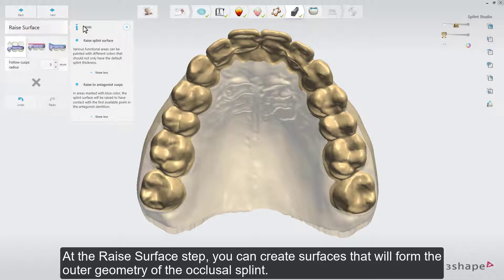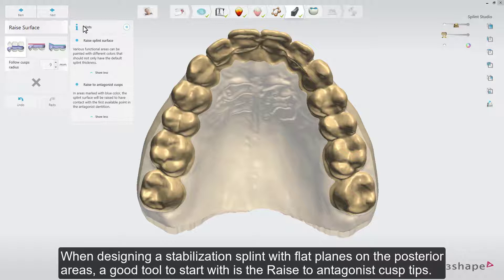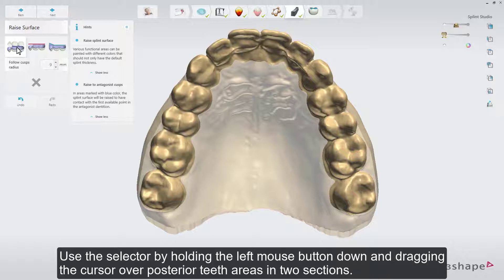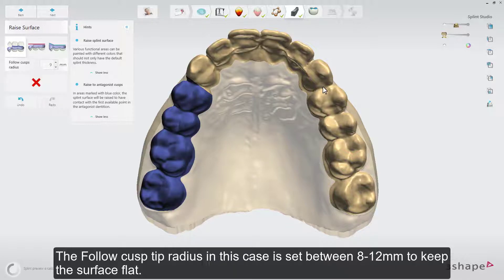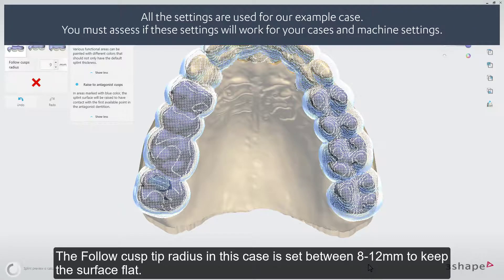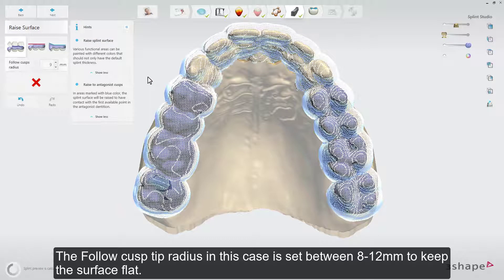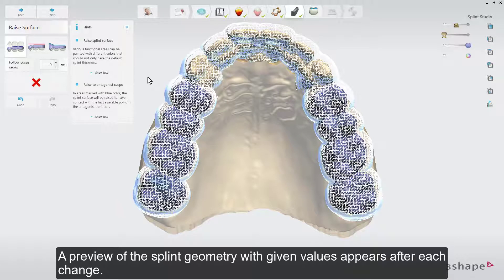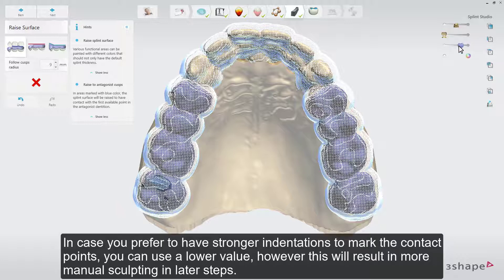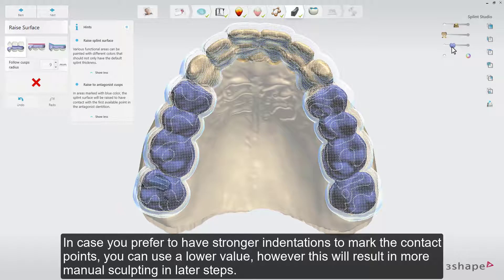At the raised surface step, you can create surfaces that will form the outer geometry of the occlusal splint. When designing a stabilization splint with flat planes on the posterior areas, a good tool to start with is the raised to antagonist cusp tips. Use the selector by holding the left mouse button down and dragging the cursor over posterior teeth areas in two sections. The follow cusp tip radius in this case is set between 8 to 12 mm to keep the surface flat. A preview of the splint geometry with given values appears after each change. In case you prefer stronger indentations to mark the contact points, you can use a lower value; however, this will result in more manual sculpting in later steps.